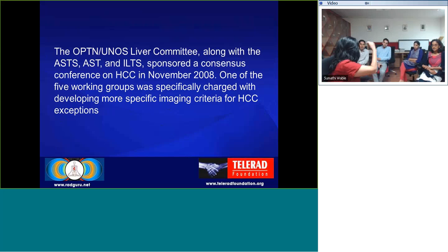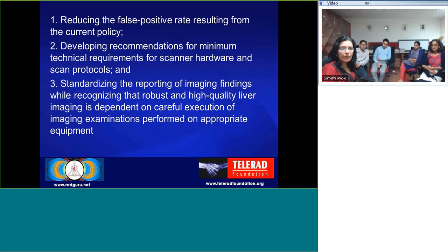They are even very specific as to the requirements of what sequences, because there were radiologists involved in this also. So these are some things that, even before you start looking at the cases, you want to make sure you have everything the way you want, because you are trying to find disease on top of disease, which is very difficult.